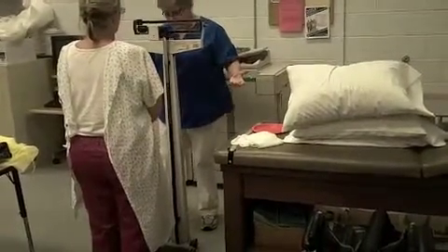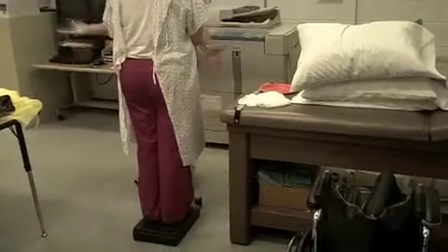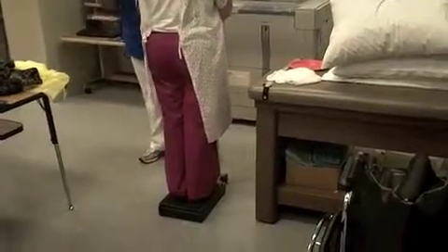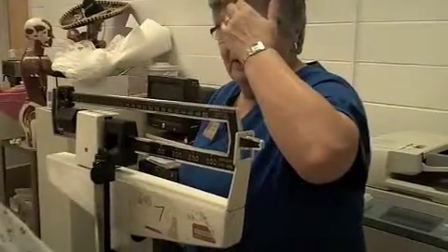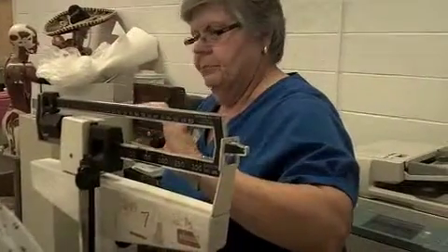And it is. Okay? If you will step up in the middle of the scale, notice there's no paper towel because they're wearing shoes. Okay? And I know that you teach them the possibility of paper towel. That's if they're barefooted. But they got shoes on, so there's no paper towel. We balanced it. Now, I talked about this at summer conference, and I can't remember who did the little station for me, but an easy way to get this weight right.